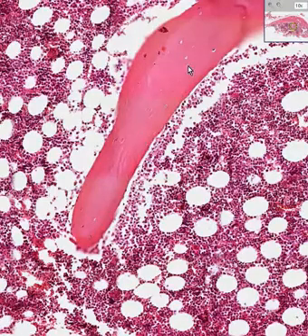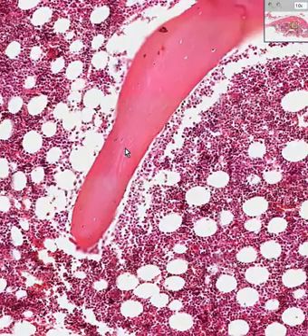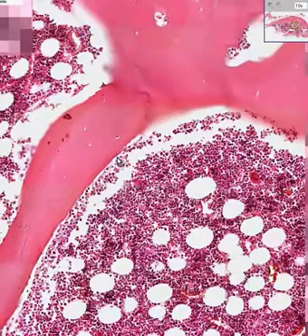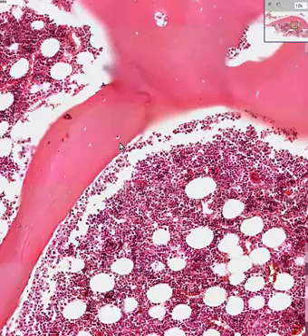You see a more concentric or lamellar deposition of bone. But the principle is the same. You have these rims of osteoblasts on the outside of the spicule, and as it grows, these osteoblasts get trapped within the middle of the spicule to become osteocytes.